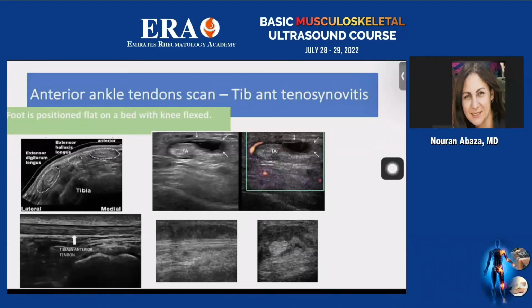But here, there is a distension for sure in the tenosynovium around the tibialis anterior in transverse pattern. And when you open your Doppler, like Professor Hea has explained the Doppler very nicely, you can see here the Doppler signal by the side of the tibialis anterior tendon, which is mainly in the synovial sheath of the tendon, but also there are parts of Doppler within the tendon.